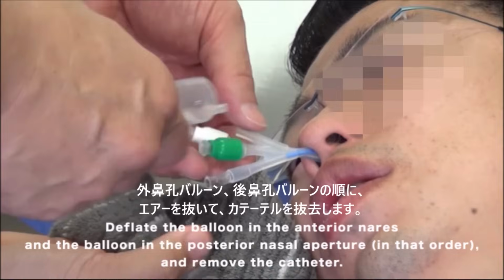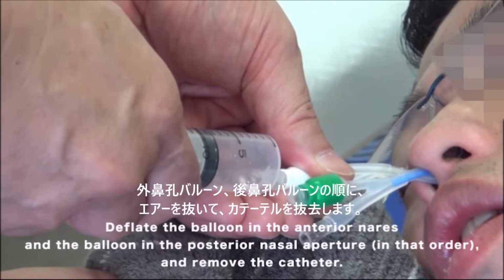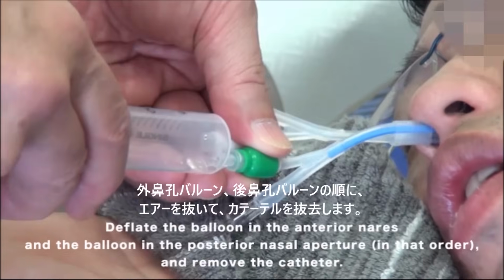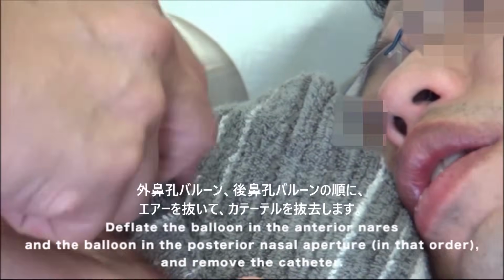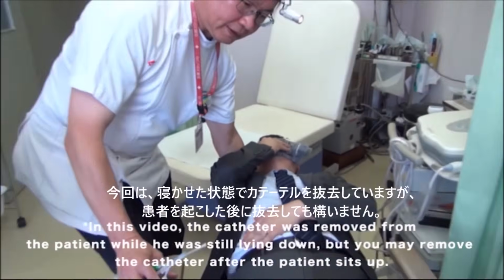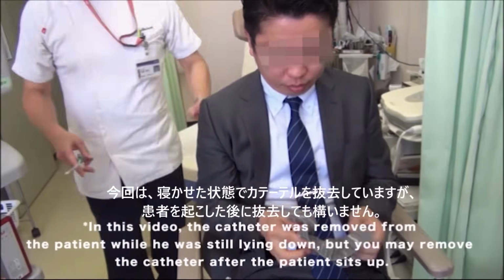Deflate the balloon in the anterior nares and the balloon in the posterior nasal aperture, in that order, and remove the catheter. Raise the patient so that large amounts of the drug formulation do not reach the throat. In this video, the catheter was removed from the patient while he was still lying down, but you may remove the catheter after the patient sits up.